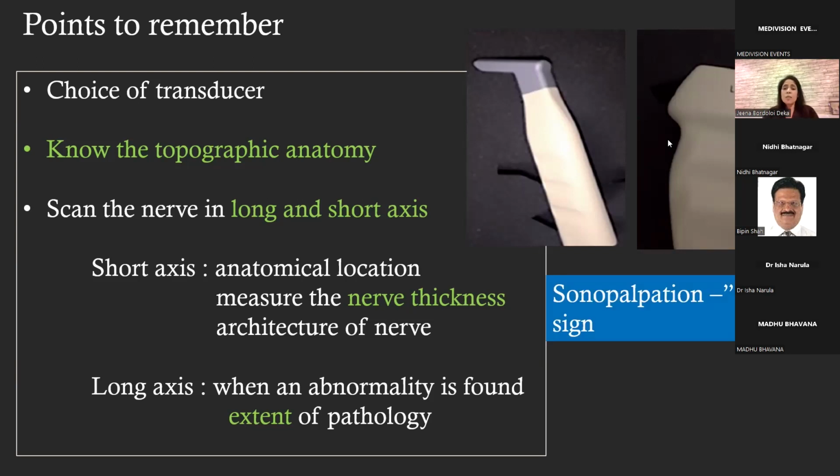And of course, there is sonopalpation, that is the Tinel sign. When we apply pressure with the transducer, it elicits the same kind of symptoms, like the pain or paresthesias or allodynia, which the patient might complain of.